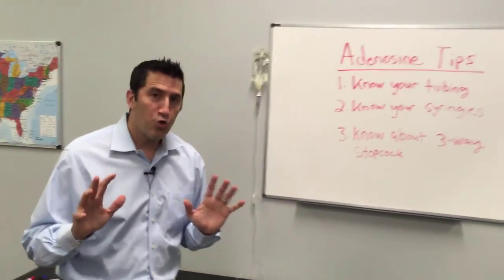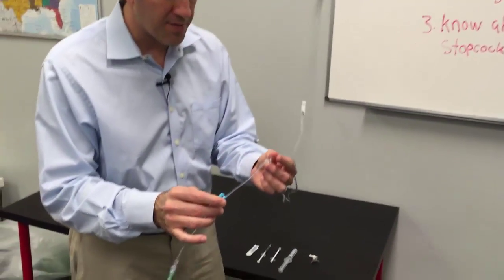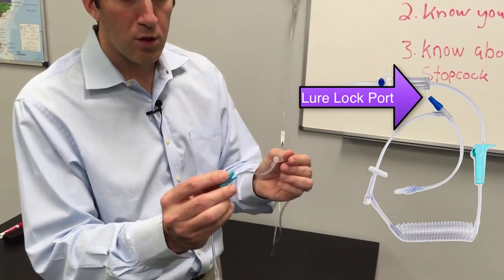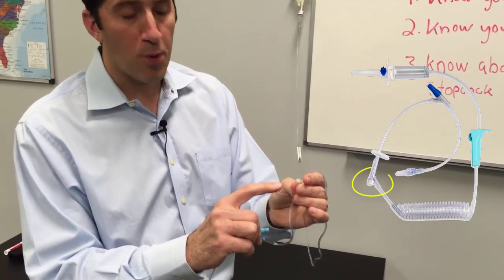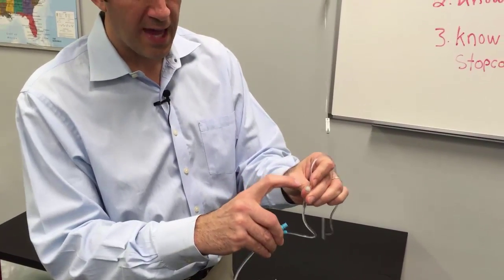Let me talk about the tubing, which is very important. What tubing do you have at your agency? Different agencies have different tubing. You can see that here we're going to the patient. This port here is a luer lock needleless port, and you also have here this needle port.